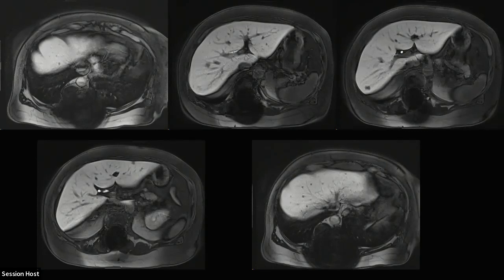So there's a small one here. There's one over here. There's one in the deep right. There's one in the back. There's another one here. So they're just kind of scattered. And this, I actually don't remember anymore because I put this together in kind of haste. These are probably resectable with a little combination of lateral left and a little bit larger resection on the right.